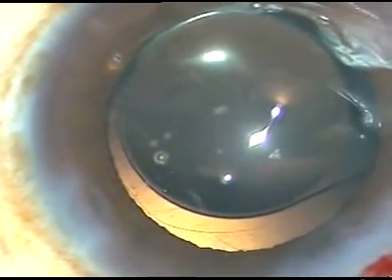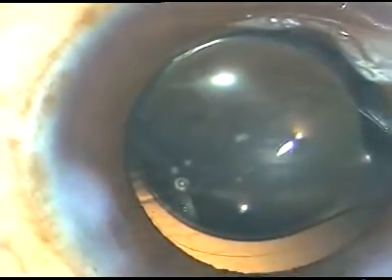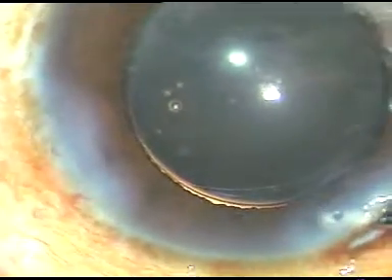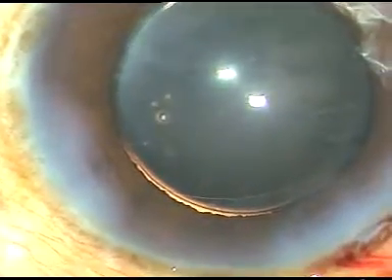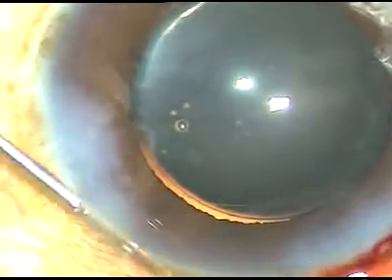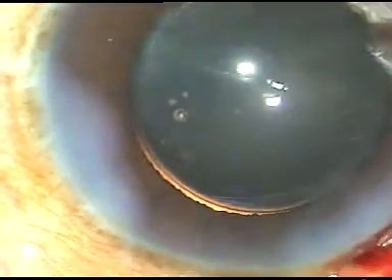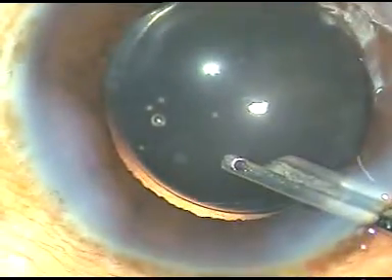Moxifloxacin is injected into the anterior chamber. Hydration of the side ports is done to make these wounds watertight. A final wash is given with BSS and the anterior chamber is formed. We must check whether the wounds are watertight or not. I found there is some leakage through the left side port, so I hydrate it again. As I hydrate, some fluid goes into the anterior chamber, so I wash the anterior chamber again. This is the final lavage of the anterior chamber.